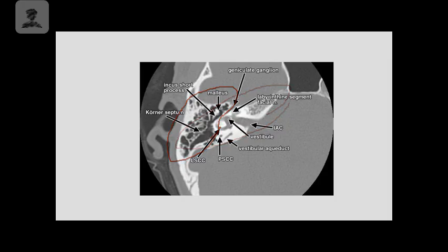Also inside of our ear, if you can actually see the ear tissue and flap off to the side, that's coming up against the skull. We would actually be able to follow that all the way in. It's not a good image on this to see the ear canal.